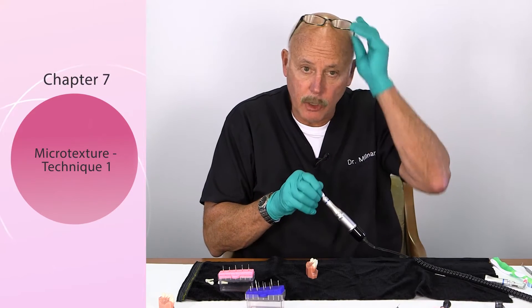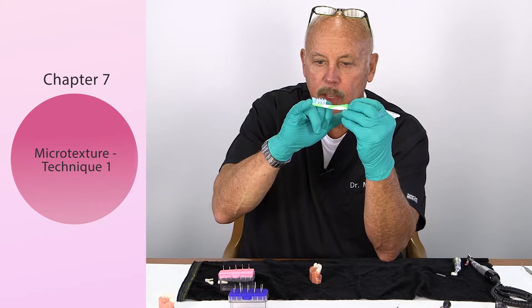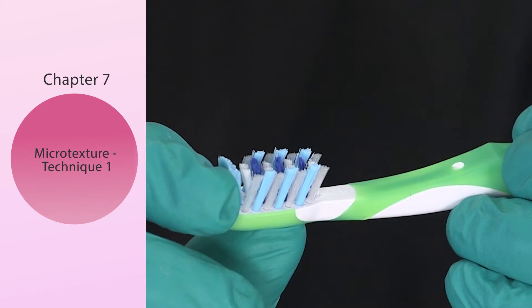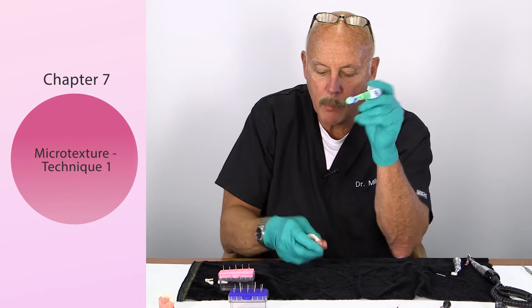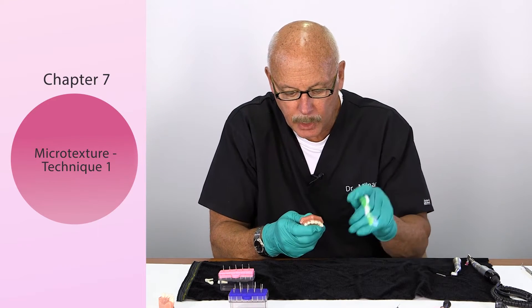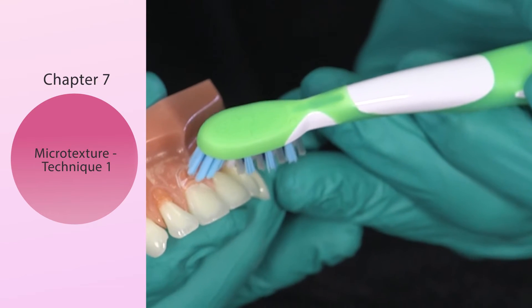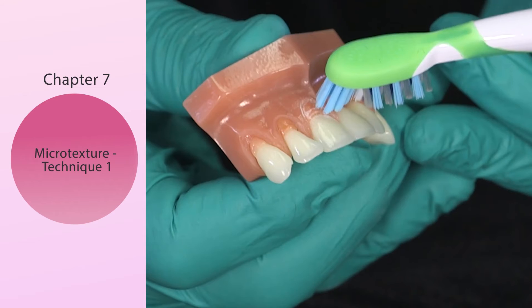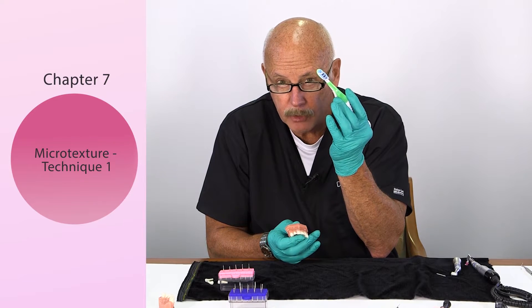Now comes the interesting part — this is called surface texture, microtexture. Look at this Oral-B children's toothbrush. What's really important is that you see how the bristles flare out — it's not a flat brush like most. What you want to do is utilize the very tip of the toothbrush to create the stippling or microtexture. If this is in the preset stage and you want to add a little microtexture, just take the bristles and do a slight stippling. You don't want to go too deep because you'll create divots that collect plaque and staining. You can just do some microtexture with an Oral-B kid's toothbrush.